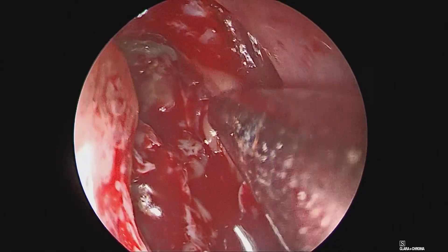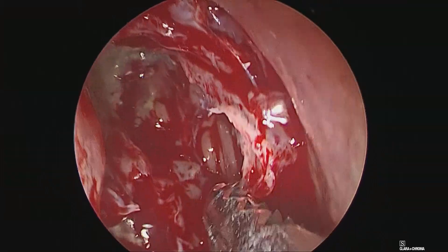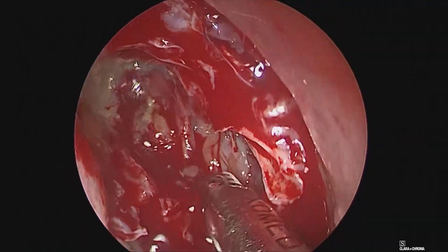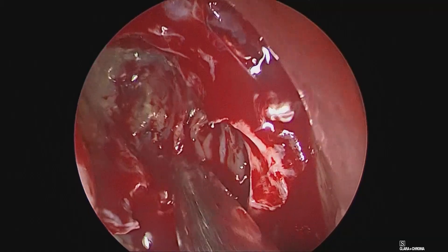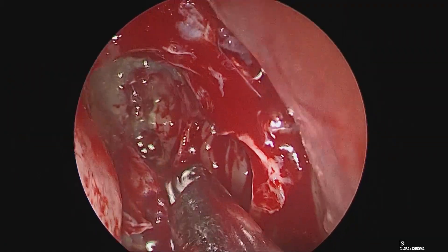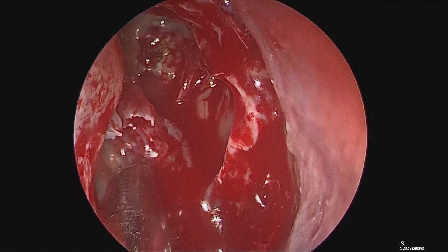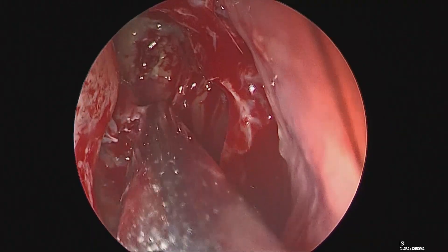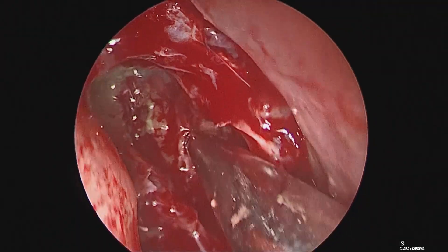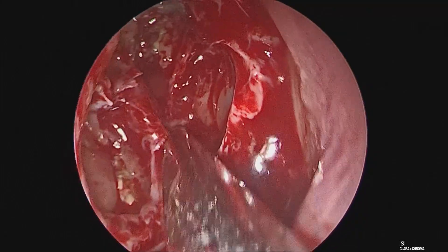Since the lamina papyracea is focally dehiscent and pushed laterally in this patient, one has to be slightly cautious with the microdebrider blade going laterally so as not to inadvertently enter the orbit and start suctioning orbital fat. At every point whenever there is some doubt, one can ballotte the orbit and check for the approximation of the surgical instruments to the orbit.